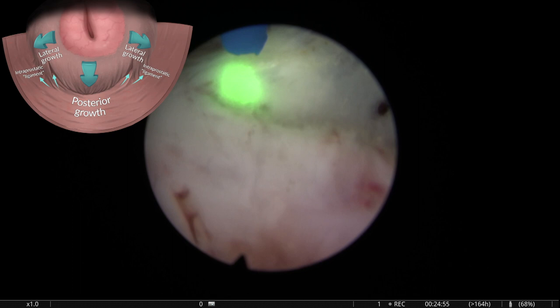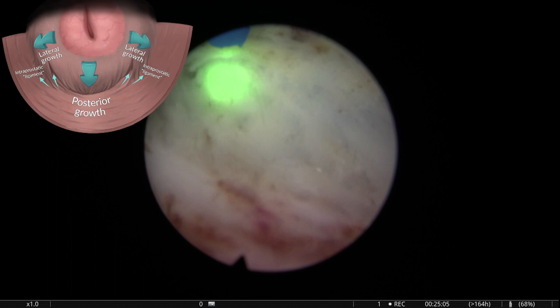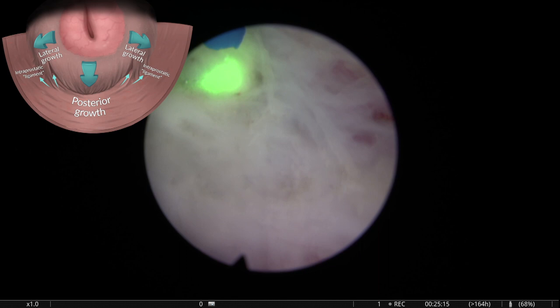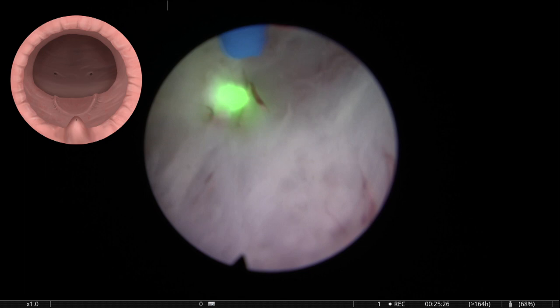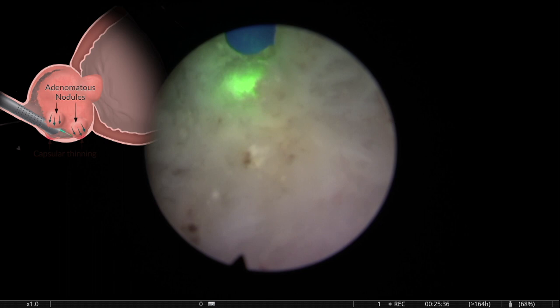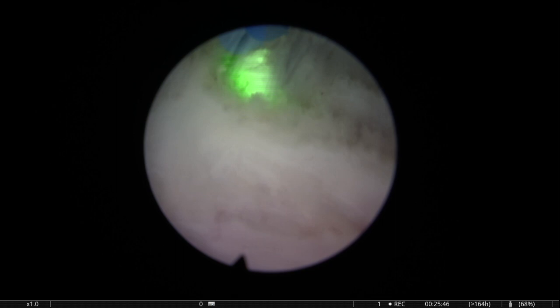Sometimes, well, we're not seeing it now anymore, but I have referred to this quite often, that many times you have to recognize that there is a lateral plane, like here, and then you get to that point where what you're seeing is the imprint of the middle lobe on the capsule, and there seems to be a change of direction. So always try to go to the limit. Always try to find these nodules, and if you see yellow tissue, probe it, go there and see if you can take it out, because that's probably an adenomatous nodule.